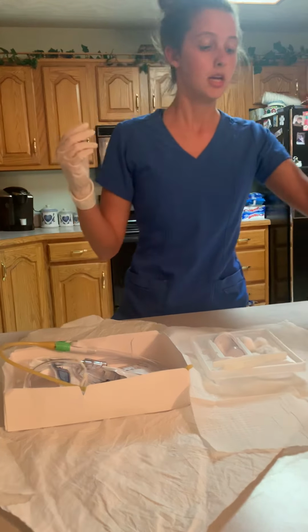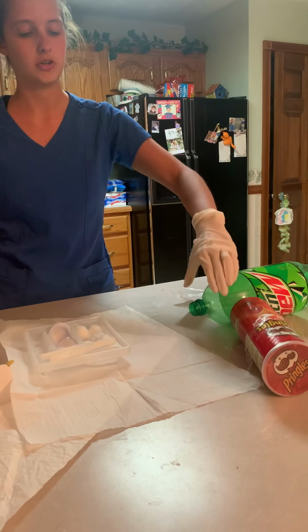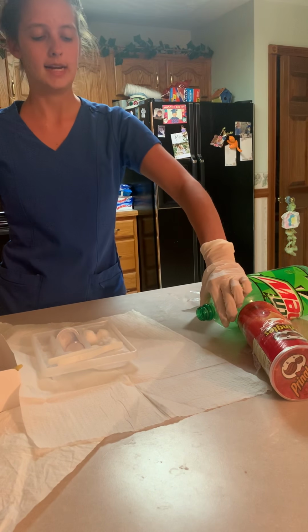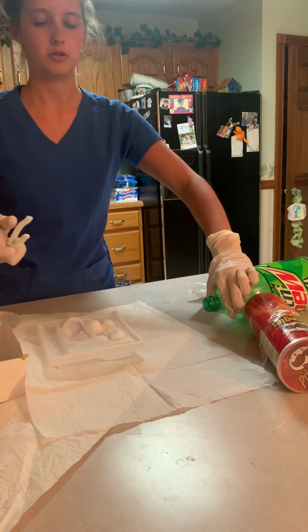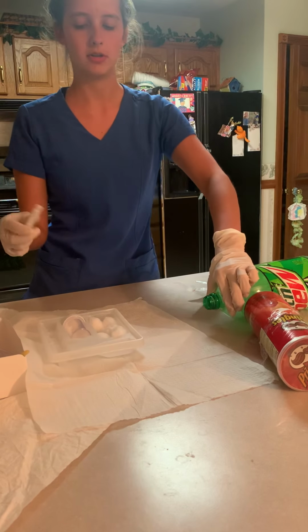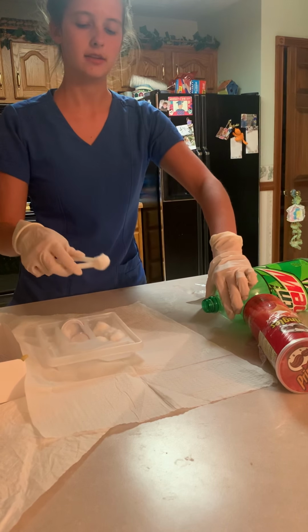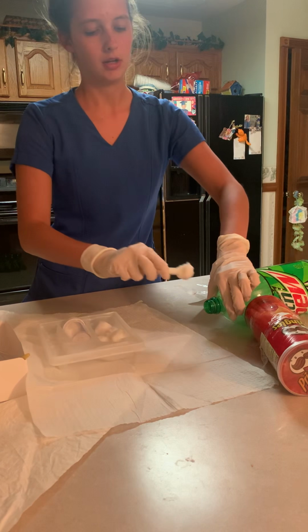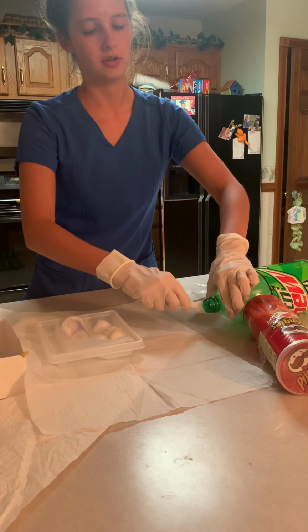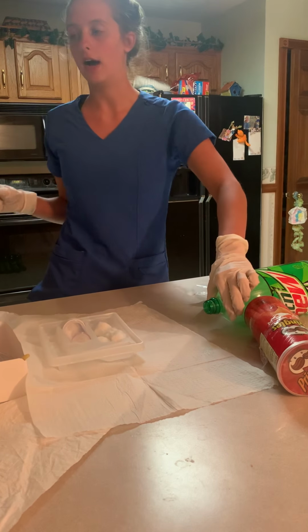Okay, and next what I'm going to do is use my non-dominant hand and grasp the penis at a 90-degree angle. I'm going to pick up my forceps and use my cotton balls that are covered in betadine to clean the urethral meatus. We're going to clean the urethral meatus in a circular motion. Then we're going to go out and away.